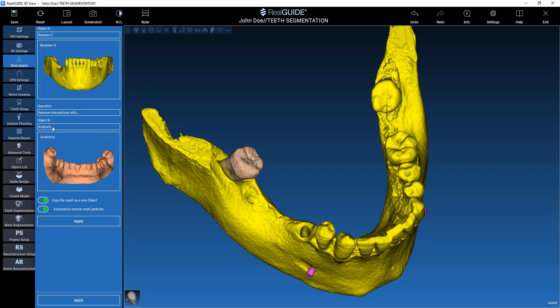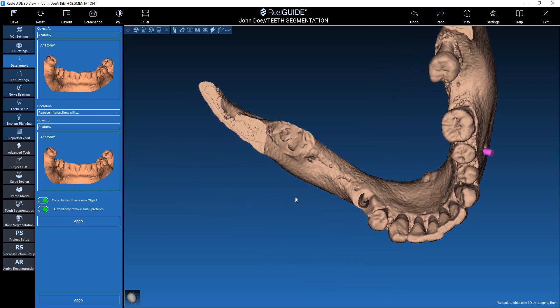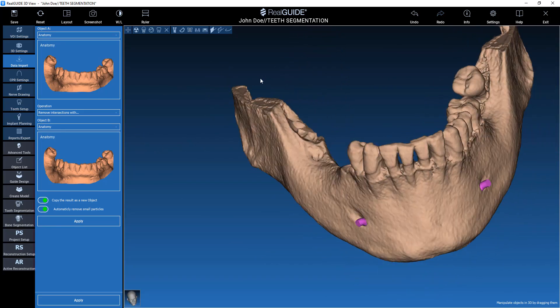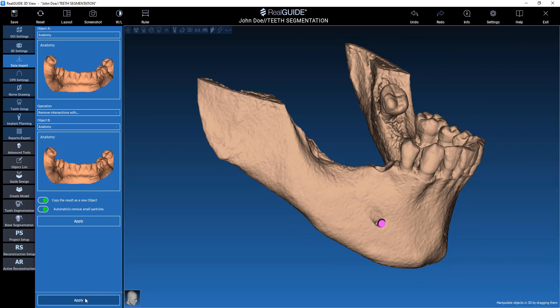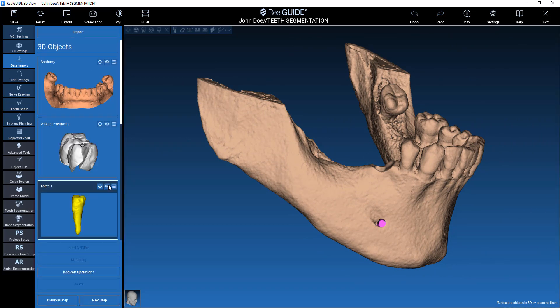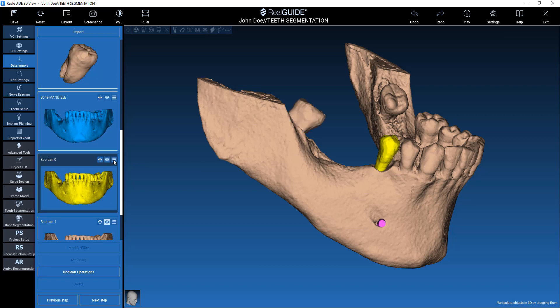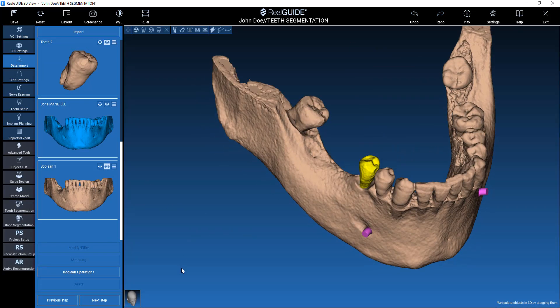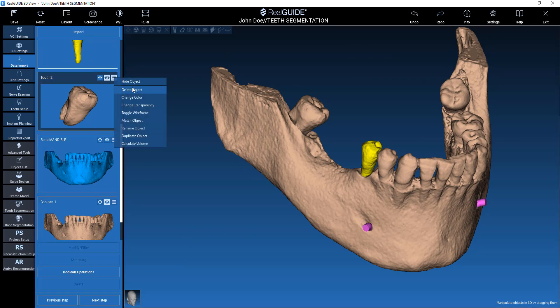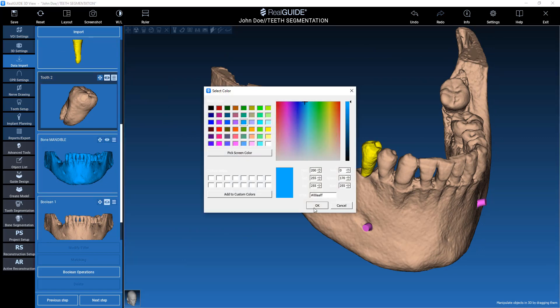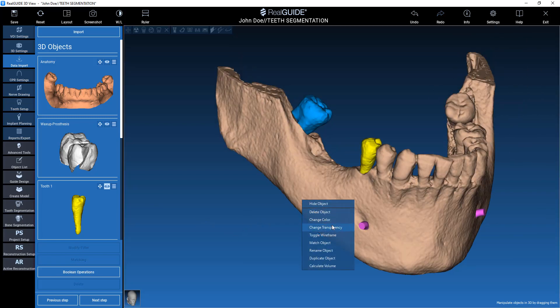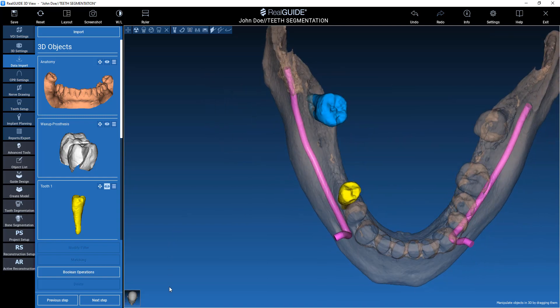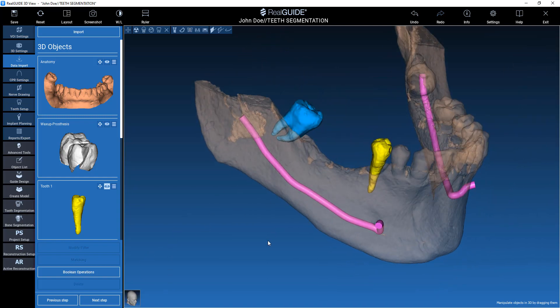Take the boolean, remove intersection with tooth number two, and apply. Now we have our finished boolean operation. Click on apply. Now I can delete my files, change the color of this object, and this is my finished segmentation.